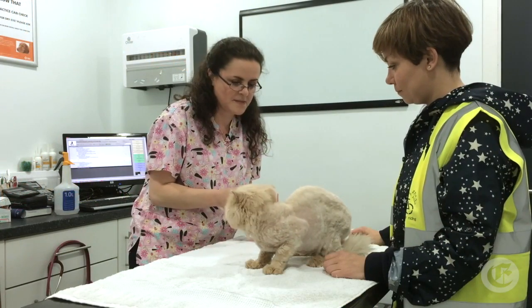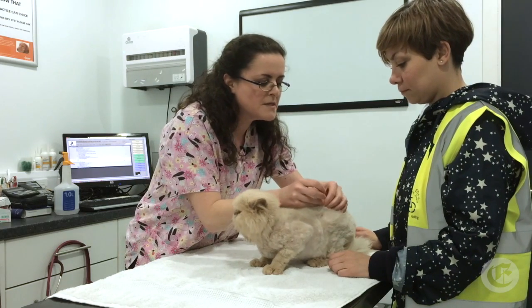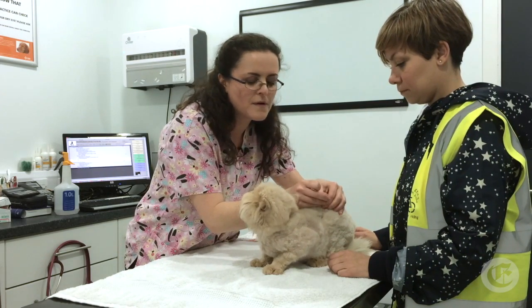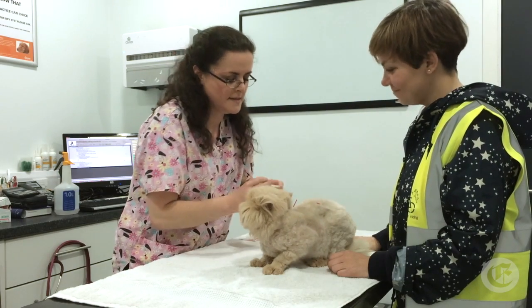With cats, sometimes they'll tolerate so much and then if you overdo it, they'll go nuts. So you've got to be really quite careful. So I'm using much finer needles this time.